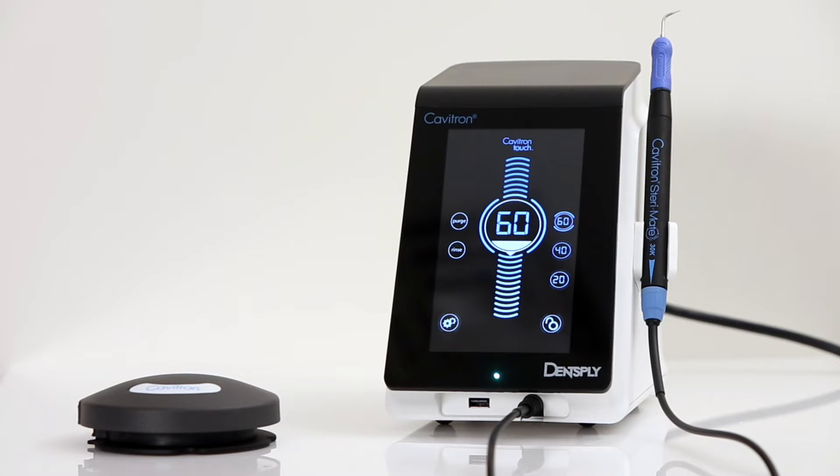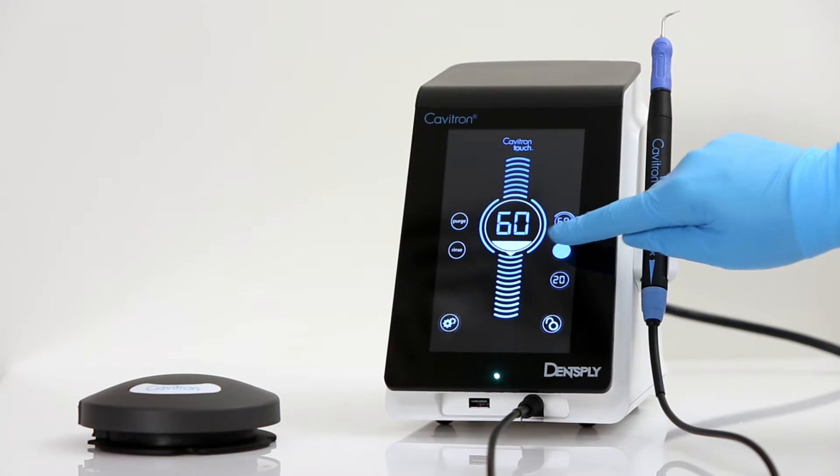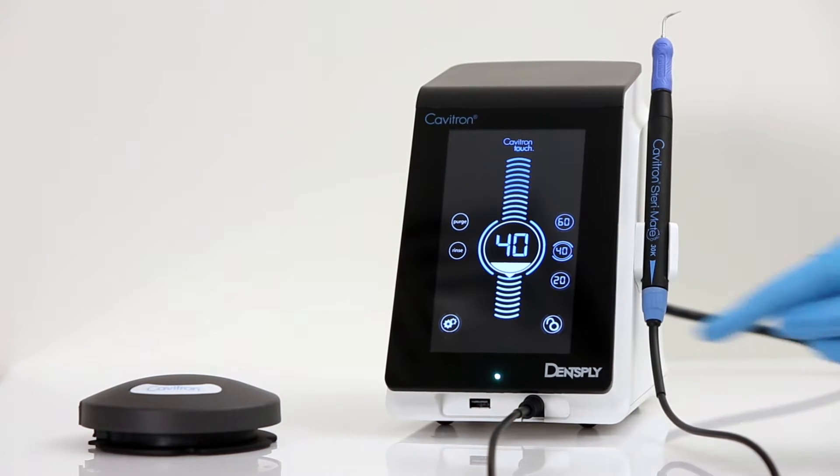This is the scaling screen of the Cavitron Touch that will allow for adjustment of the operation. Please note that the touchscreen controls will either require a tap of the icon or a tap and hold for a full 2 seconds.